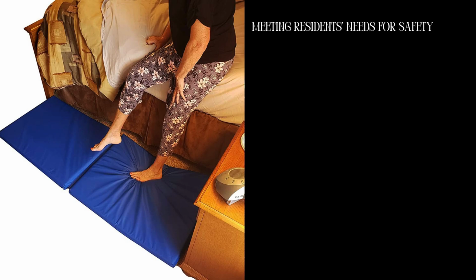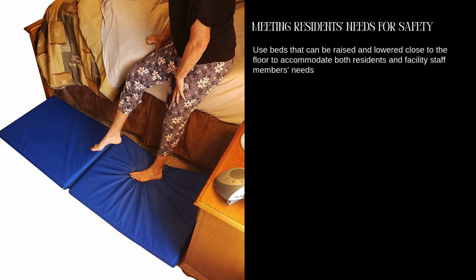Most residents can be in bed safely without bed rails. Licensees can work with residents and their designated representatives to consider the following. Use beds that can be raised and lowered close to the floor to accommodate both residents and facility staff members' needs. Keep the bed in the lowest position with wheels locked.